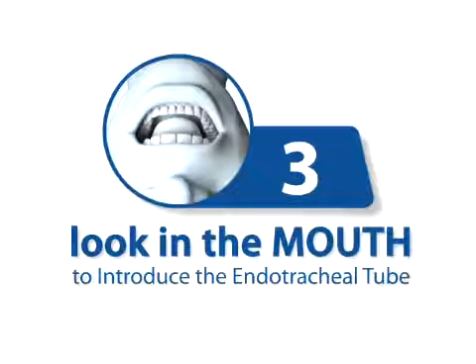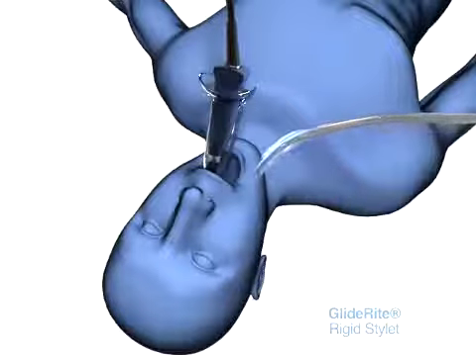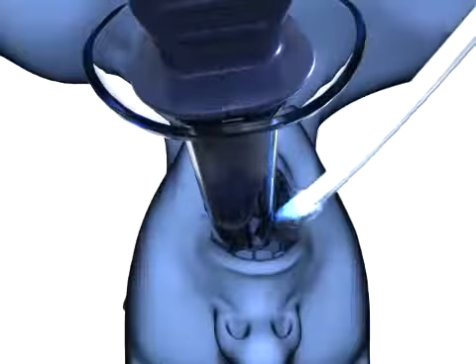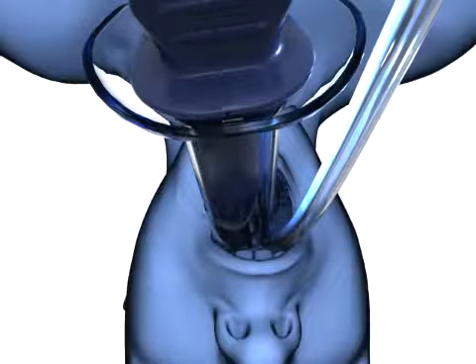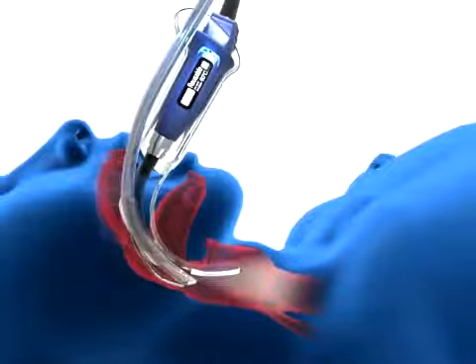However, in Step 3, it is very important that you look directly at the patient's open mouth and not at the video monitor, watching the passage of the endotracheal tube to help avoid potential injury to the tonsils or soft palate. The endotracheal tube, which in this case is shaped by a Glide-Rite rigid stylet to complement the angle of the GlideScope video laryngoscope, is inserted under direct vision until the distal tip of the tube is very near the distal tip of the laryngoscope. This relationship is quickly and easily achieved, and only then should you return to looking at the video monitor.